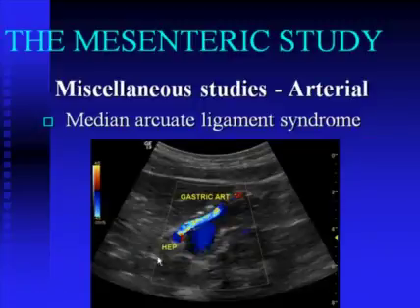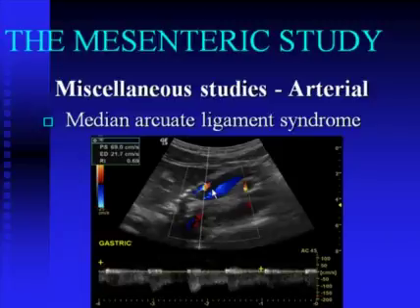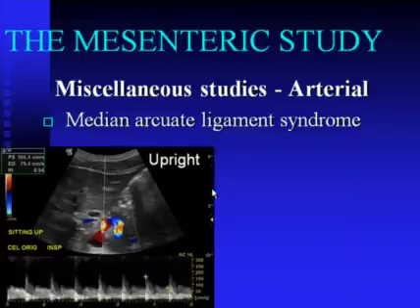In this case, we just saw also a large gastric artery with retrograde flow filling the hepatic artery, so there was evidence of chronicity indicated by collateral filling of the hepatic artery. And again, the flow direction in that gastric artery indicates retrograde flow and collateral filling. But the second maneuver, as I mentioned, is to sit the patient upright and repeat the celiac trunk measurements.